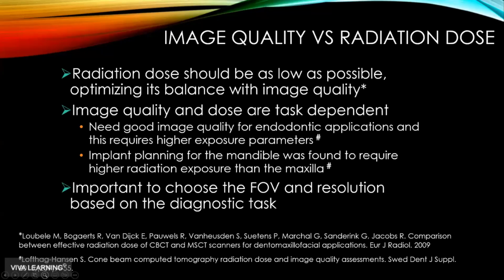So if we're going to do an endodontic survey, we really need very high image quality, which means, as I mentioned earlier, if we want a high resolution scan, we need much smaller voxel size. We need more data for the computer to look at so that it can give us that nice high resolution and we can see what we want to see.